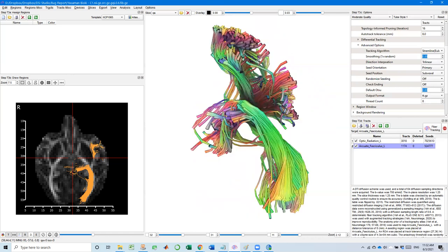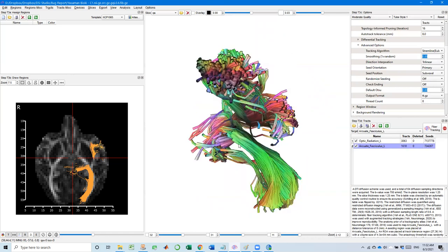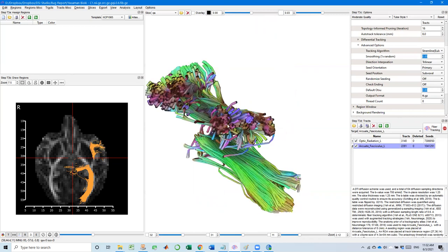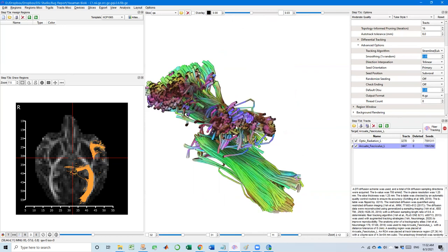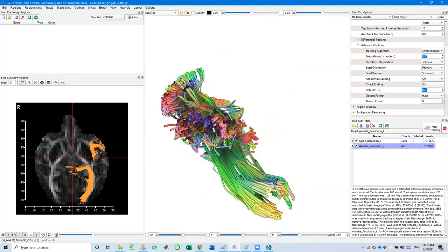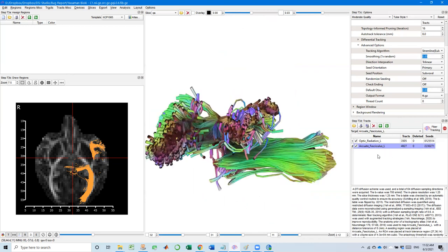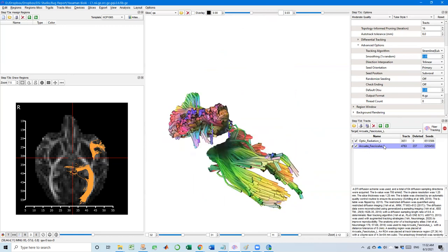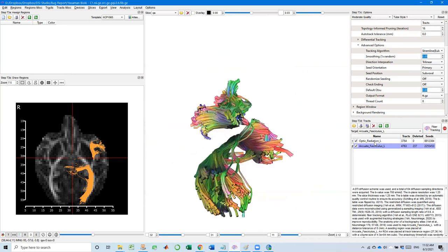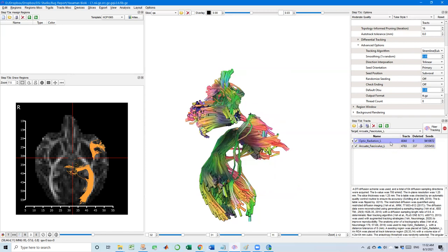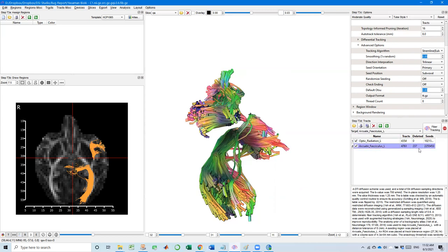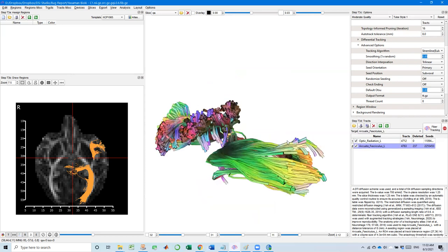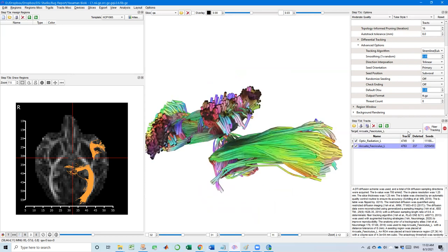It's nice. So monkey arcuate fasciculus doesn't really have like a large C shape. Usually they go close, similar to SLF. You see here, the arcuate fasciculus already finished because we increased the thread count. Optic radiation is still going. So once it reaches 5,000 tracks, then pruning will remove some noisy tracks. So for example, here, arcuate fasciculus, some of the 200 tracks have been removed because the pruning figured out those are very noisy and removed them.